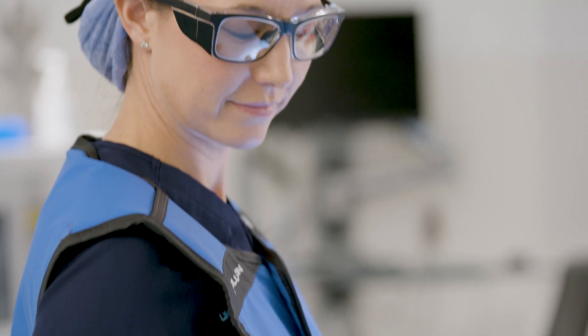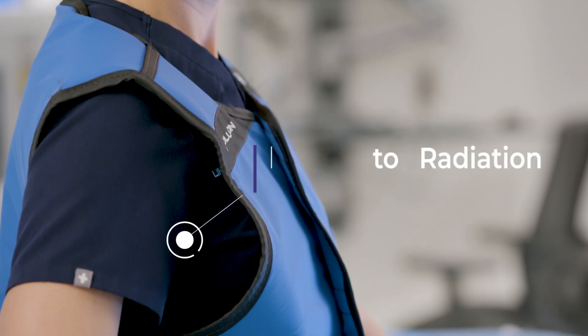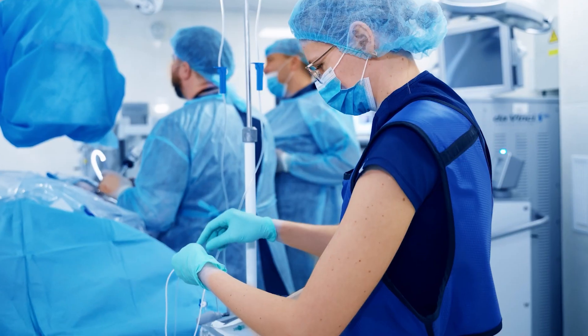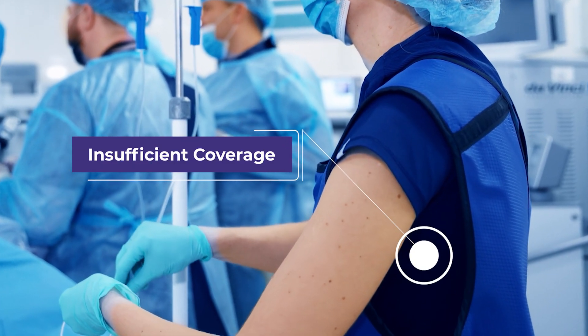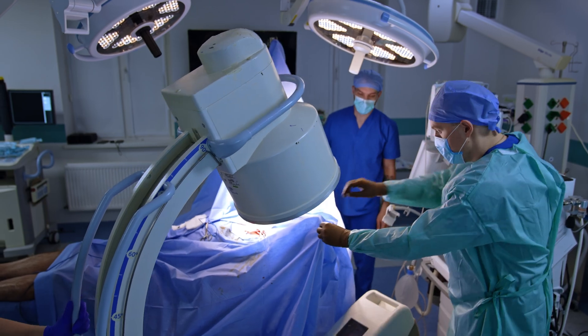We found out that even in well-fitted aprons or vests, the upper outer quadrant and the axilla were not well covered. Aprons that were too large or too small provided even less coverage. The axilla and that part of the body is also vulnerable to radiation, as is the heart, lungs, and spine in that area.